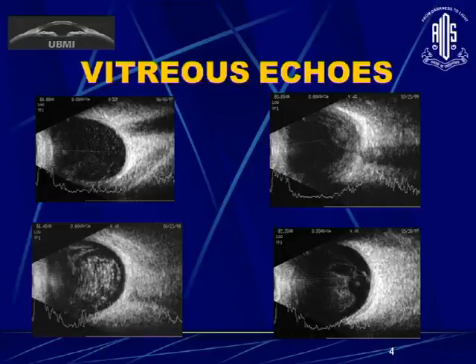these are, as I tell always in any session, only by vitreous echoes it's difficult to say whether it is infection or hemorrhage. These are vitreous floaters. That is more likely to be inflammatory echoes because there is thickening of the chorioretinal layer, and we can grade the inflammation in terms of vitritis, endophthalmitis, and panophthalmitis.